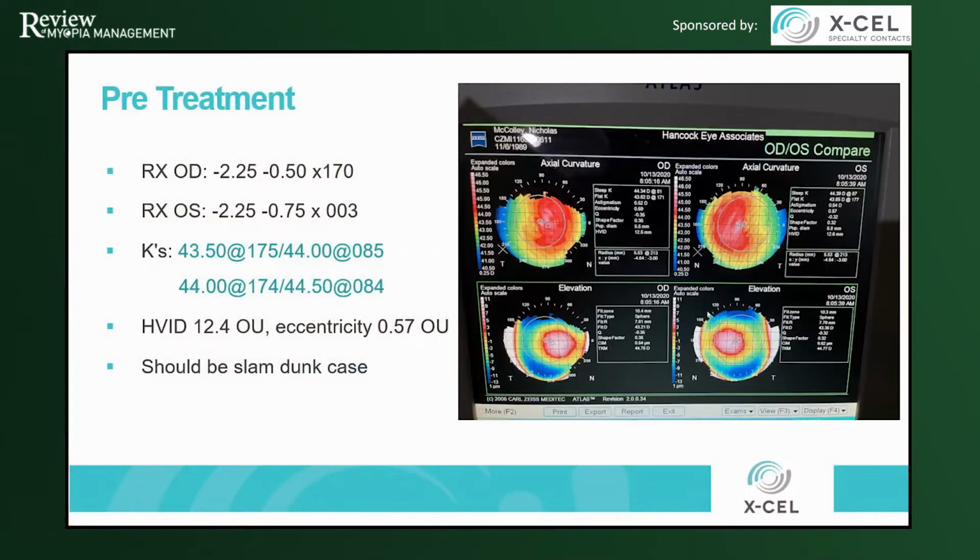Today, we're going to be talking about a case study for myself, actually, because I'm a very, very difficult patient, as I found out starting in optometry school. My first time trying to be fit in OrthoK lenses, I was in optometry school and I had a few professors perplexed. We couldn't just get the fit right. So recently I started to try again, a few months ago.